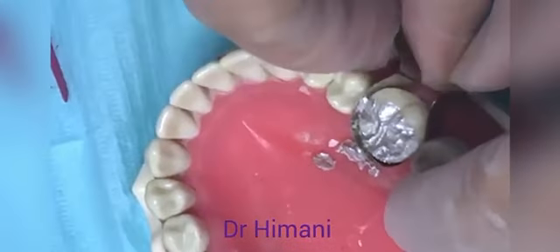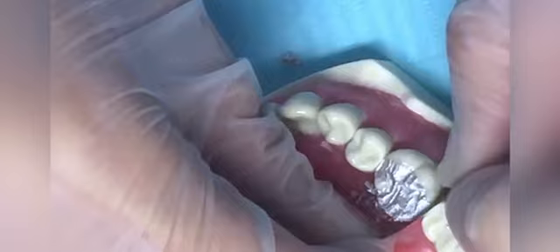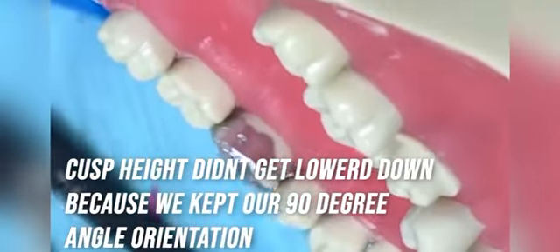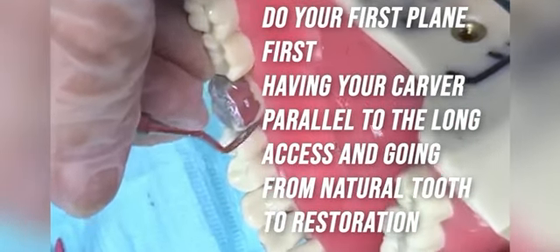Hi guys, let's have a small video on how to do the basic anatomy once you're done with the amalgam restoration filling. So try to condense your amalgam perfectly. Do it increment-wise and use proper pressure until your wrist hurts. While you remove the band, I suggest do not remove the wedges because the chances that the amalgam breaks are high.